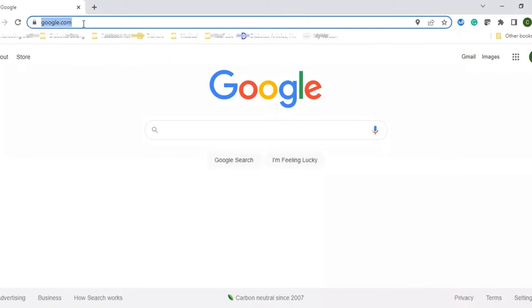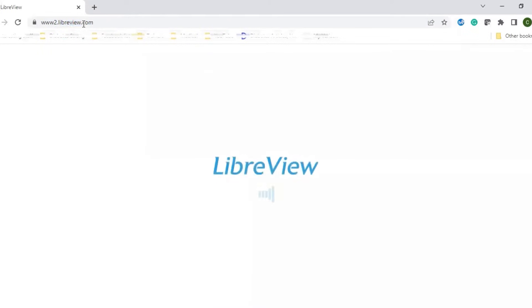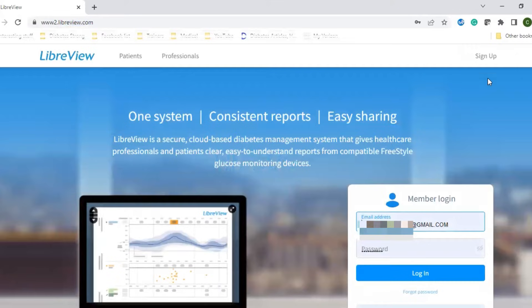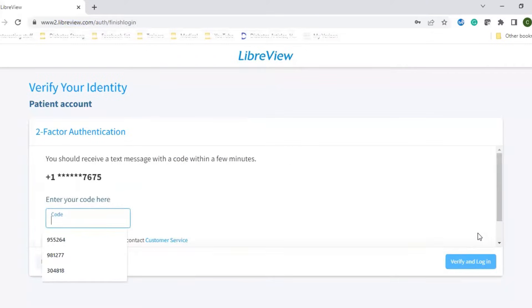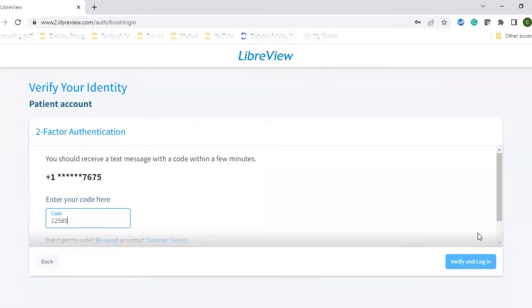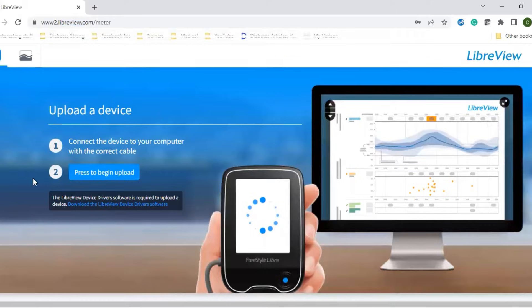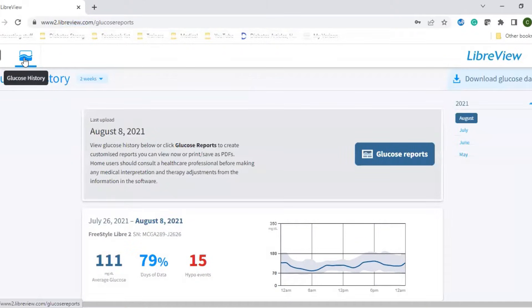Let's start by downloading that Libre report. Open a browser and type in LibreView.com. You want to sign up if you haven't done that. My email and password are already populated so I'll click login. I have two-factor authentication — I recommend that. I ask it to send me a code to my cell phone, type that in, and then simply click download. If you use the reader you'll want to upload your device. If you're using the app, click up in the left-hand corner.